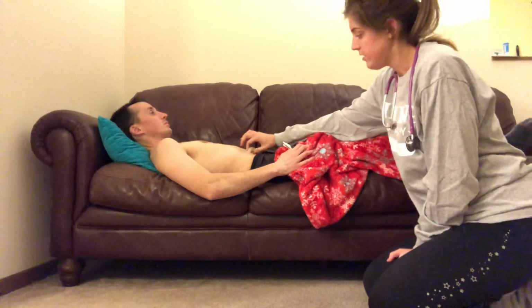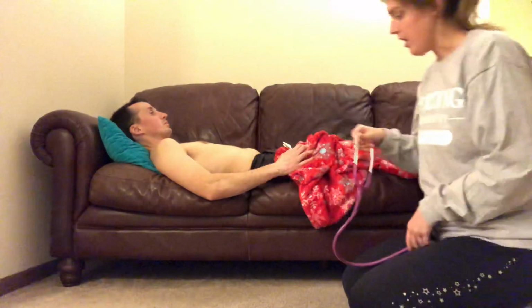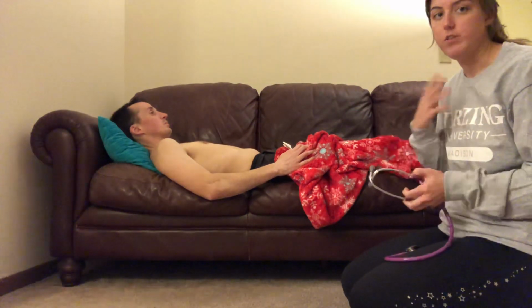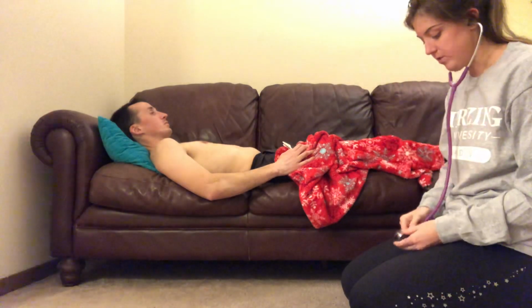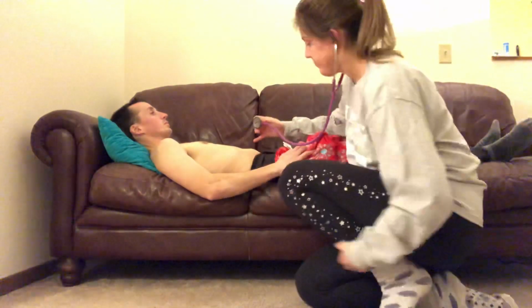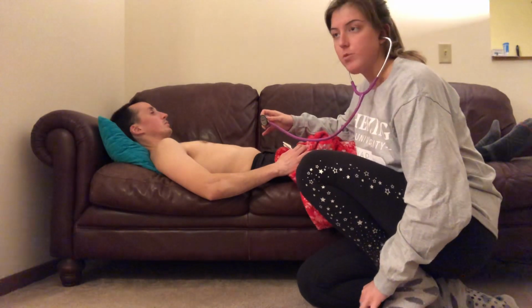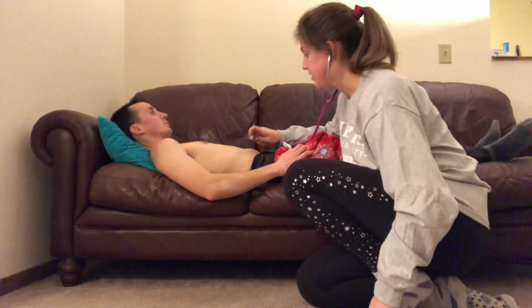I'm going to do skin turgor. And I'm also noting during this his generalized affect. Start auscultation with the diaphragm. I'm going to start in the right lower quadrant, and I would listen for 1 minute each quadrant, and 5 minutes if there's absent bowel sounds.